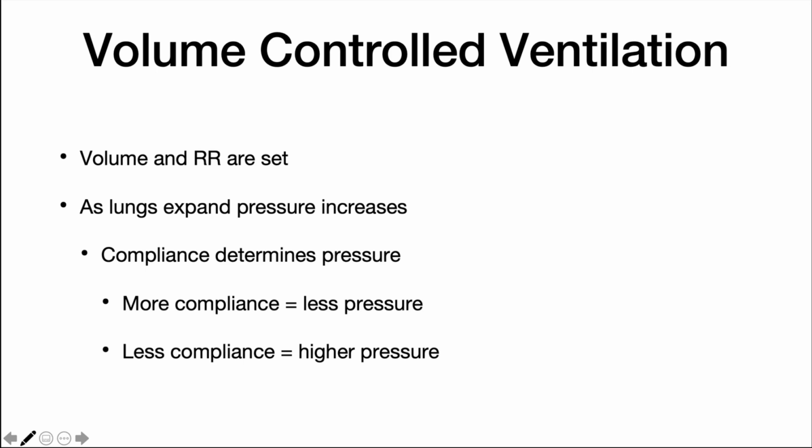In volume-controlled ventilation, airway pressures can vary. With patients with severe hypoxemia from ARDS or requiring high PEEP and FiO2 settings to maintain adequate oxygenation, the airway pressures that are generated to deliver the desired tidal volume will increase. This increasing pressure can be measured as the peak inspiratory pressure, the mean airway pressure, or the plateau pressure, all of which attempt to describe the pressures that are transmitted through the airways at different levels and at different points in the respiratory cycle. As the plateau pressure increases, reflecting increased alveolar pressure, it may be prudent to use a more pressure-controlled variant of ACV.